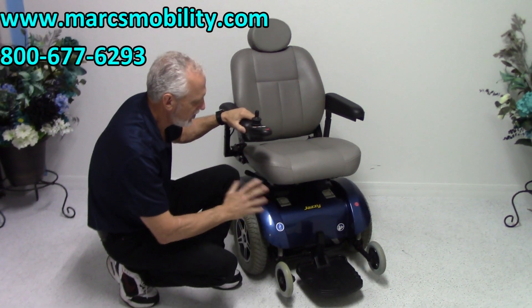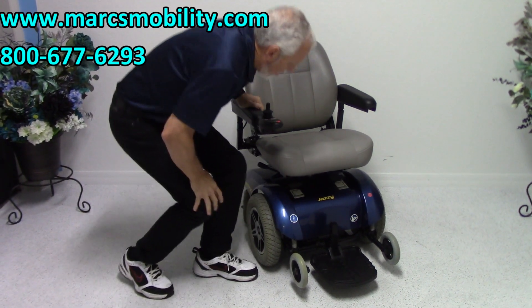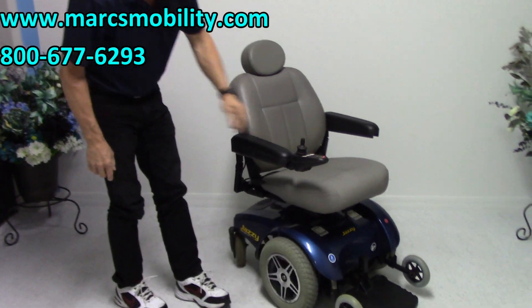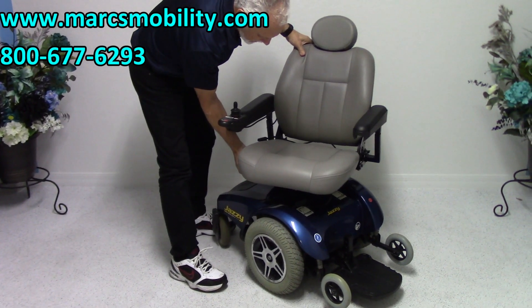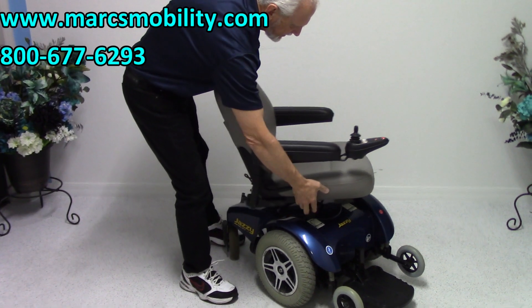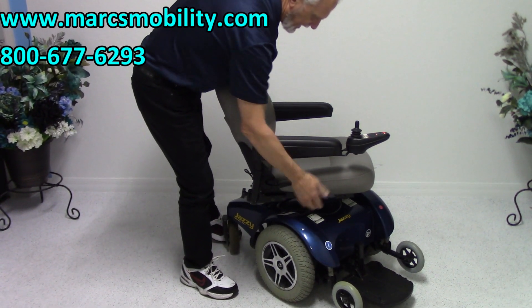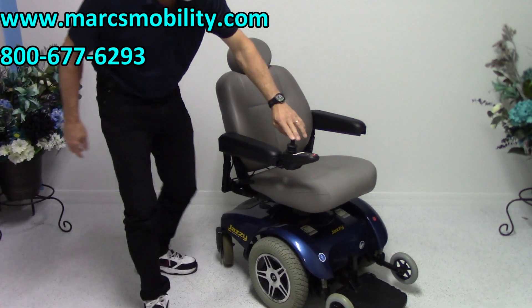Always turn the power off if you're going to put it in neutral, because it will take the resistance off the motors. Also, this chair has a swivel seat — there's a handle here and you can swivel the seat all the way to the side, either side. The seat will lock in several different positions, so it's a swivel seat.